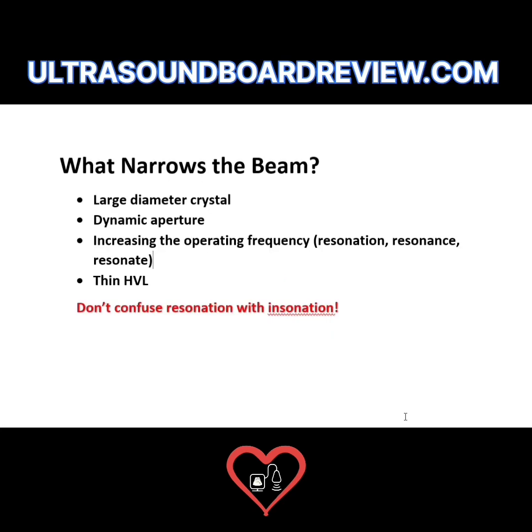So in summary, what narrows the beam? Large diameter crystals, dynamic aperture. When you increase the operating frequency, you're increasing the resonation, the resonance, and the resonant. Also a thin half-value layer. But don't confuse resonation with insonation.